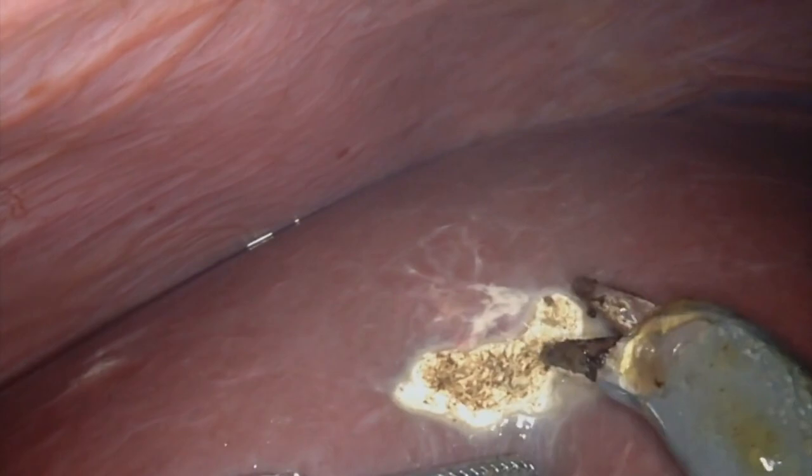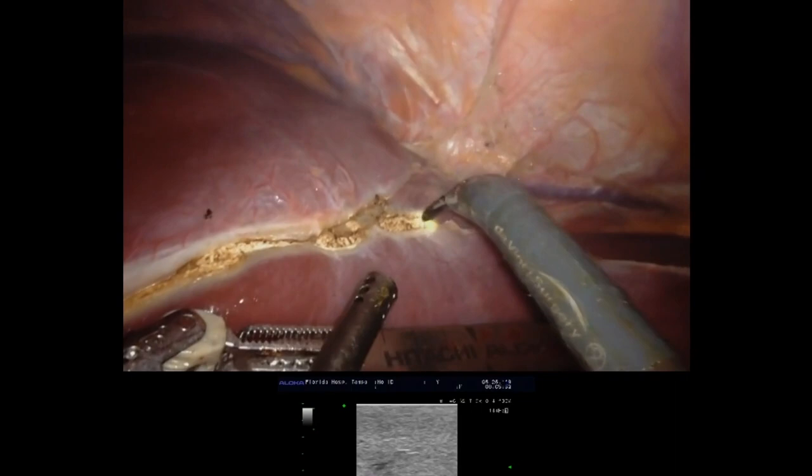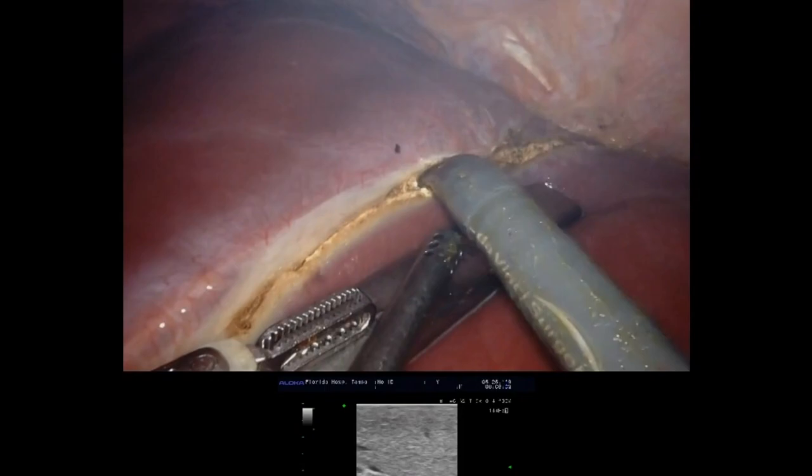This biopsy was sent to pathology for frozen section. Intraoperative liver ultrasound was done to confirm the presence of the lesion in segment 3 of the liver. While examining the liver, we also drew the transection line where the liver excision will be done to remove the liver lesion with negative margins.